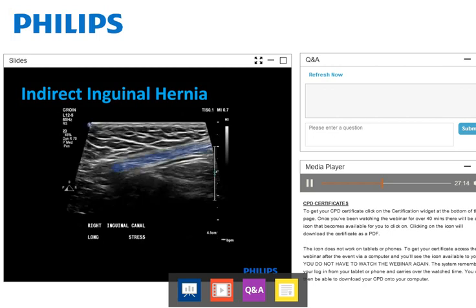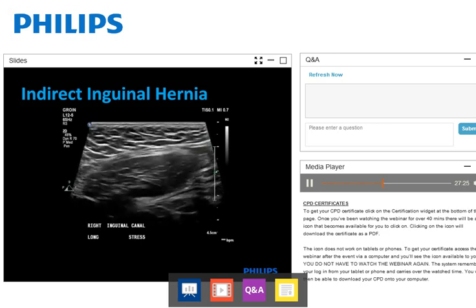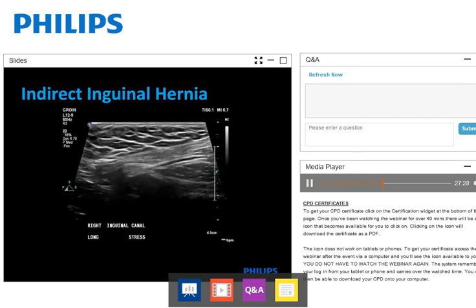Here's another indirect inguinal hernia. Once again, we can see our inguinal canal here in blue. Lateral is to the left of the image. And we can see here now as the patient strains, the abdominal fat moving quite horizontally, coming straight in through the canal there and going all the way in and then coming back. So that primarily horizontal movement of the fat is another good indication that it's come right through that normal opening, that deep inguinal ring, and it comes through the canal.